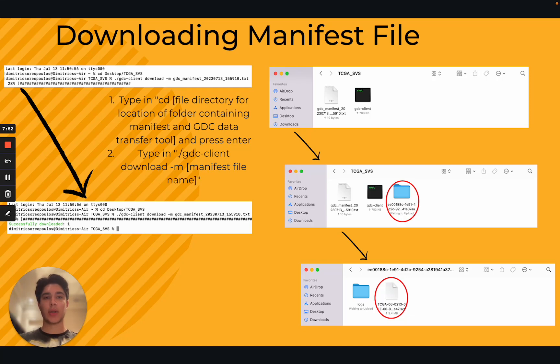Once you have opened the terminal app, begin by typing 'CD' followed by the file directory for the folder where you have stored the manifest file and GDC data transfer tool, then click enter. Finally, type './gdc-client download -m', followed by a space and the name of the manifest file including the .txt ending, then click enter once more. At this point you should see all of the slides you added to your cart begin to download in the terminal app. If you don't see any indication of this process within the next few seconds, re-download the manifest file and repeat the process. Once the files have been downloaded, a message reading 'successfully downloaded' should appear in green text in front of the number of files downloaded.